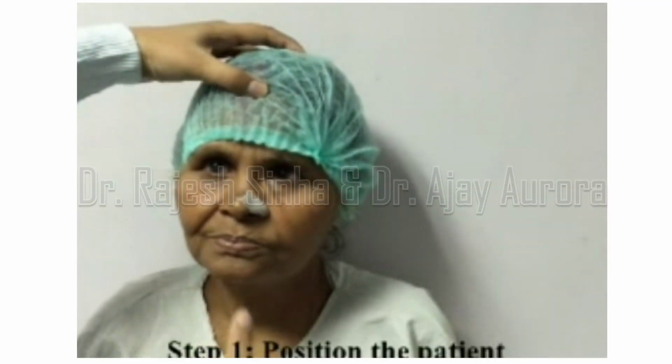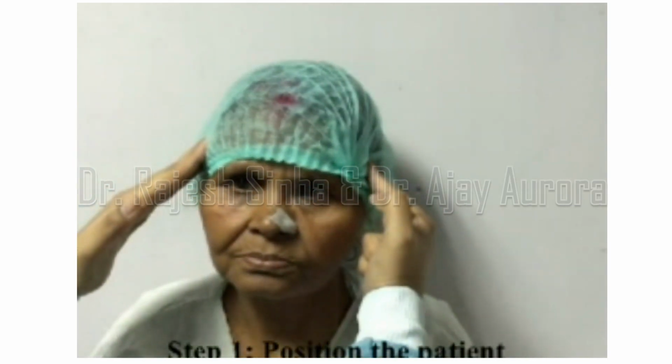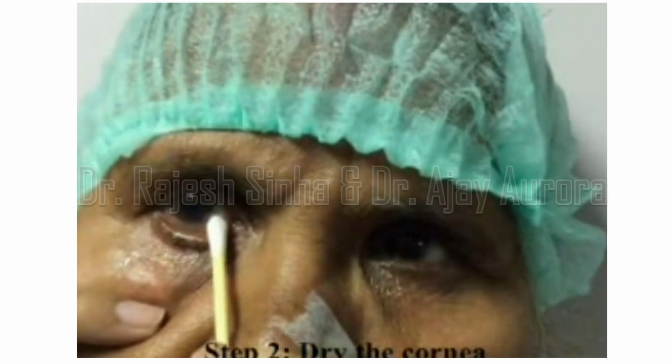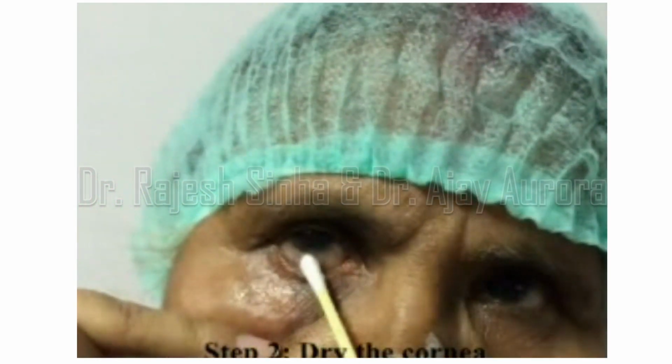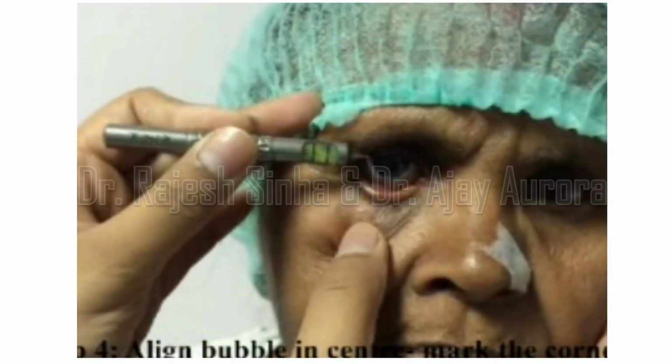For marking, the bubble marker is one instrument which is very commonly used. The important points are that the area that is to be marked should not be too wet, it should be dry, and the head position should be still and straight.